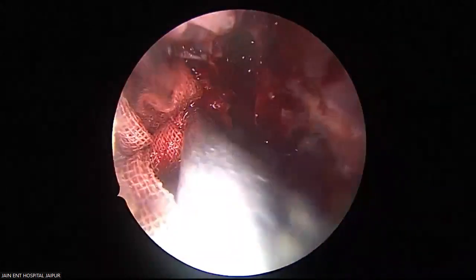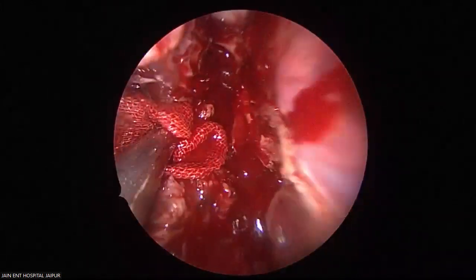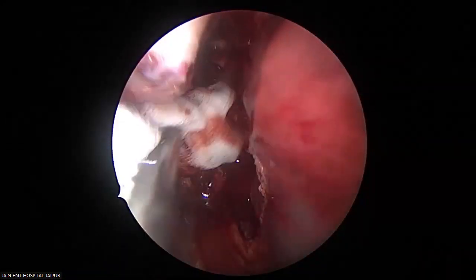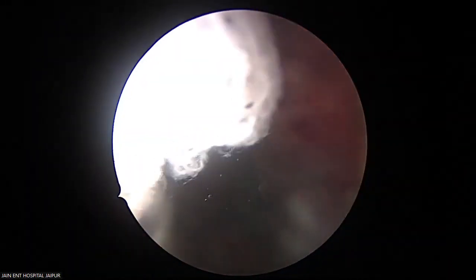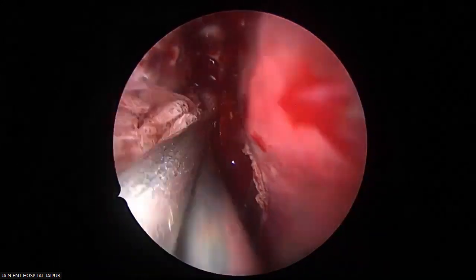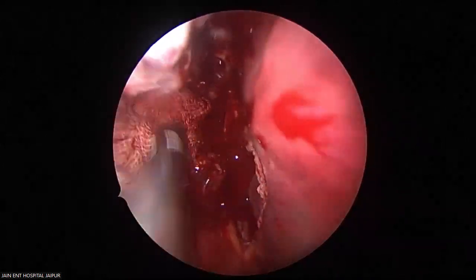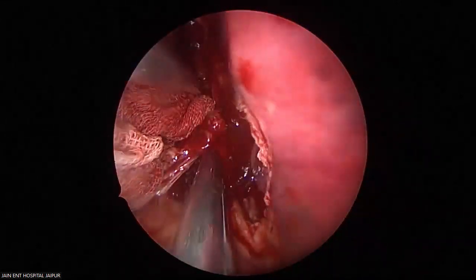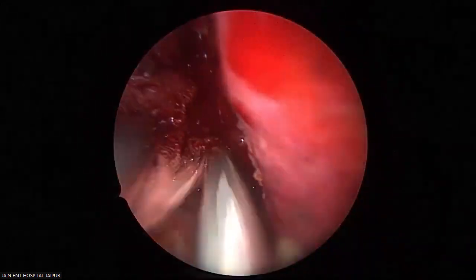See now. The metal part where we remove the tumor is being packed. See this part. I will remove the pack and show you later on. Where is the tumor? Tumor is here.